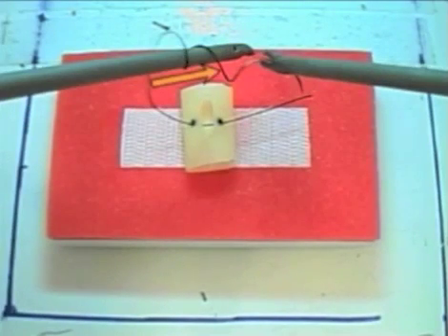The first throw is a double throw. Also notice that the heel of the needle is aligned with the driver it is wrapping around.